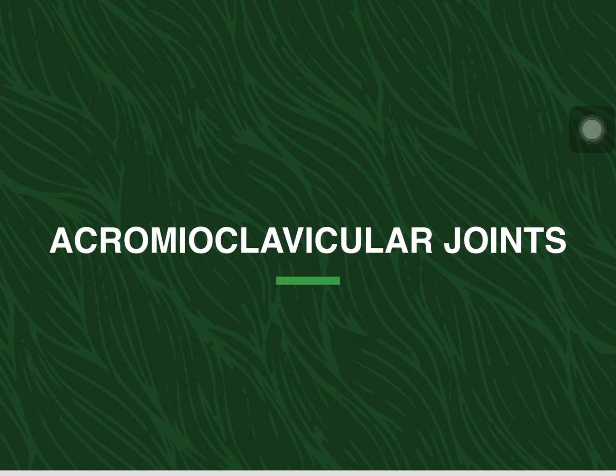So the next projections will demonstrate the acromioclavicular joints. It is between the acromion process of the scapula and the acromial extremity of the clavicle.